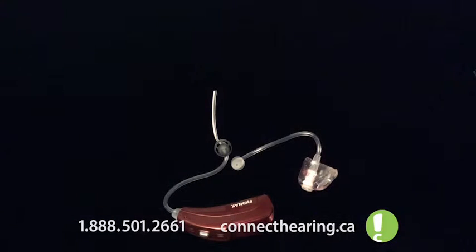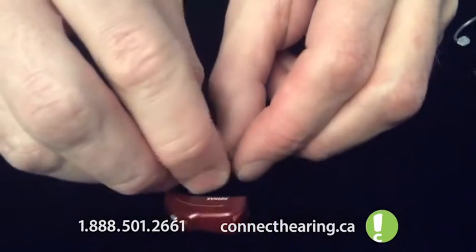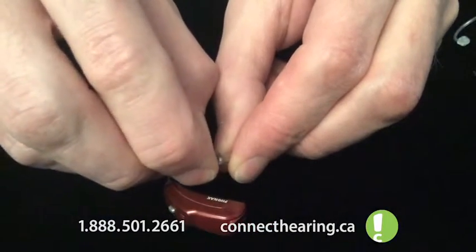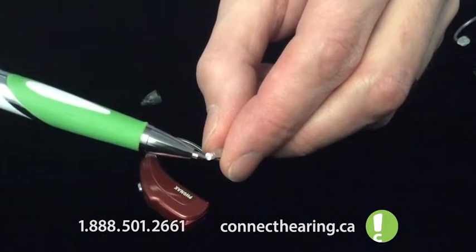First thing I'm going to do is I'm going to take off the rubber tip and show the wax guard that's in behind it. So kind of pinch it between your fingers and pull off. There's a Cerostop wax guard.